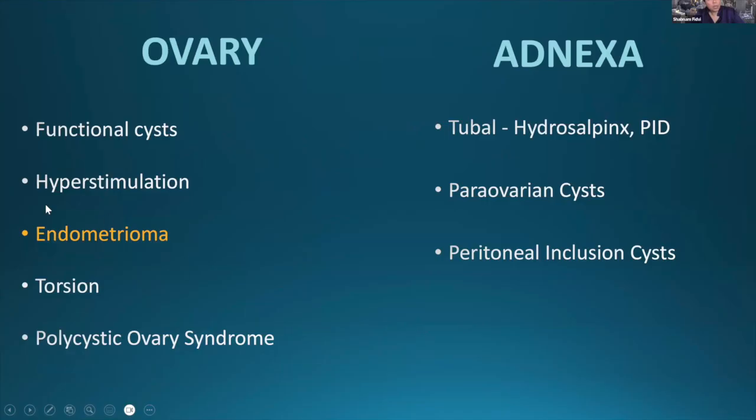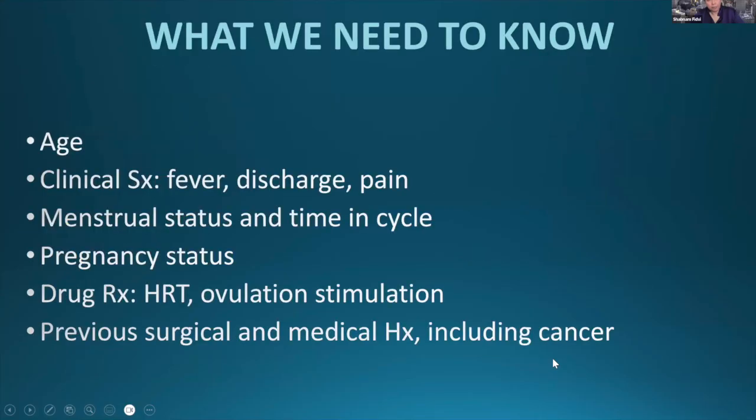I will not be talking about endometrioma because I believe this has been discussed previously in depth by one of my colleagues. In the adnexa, I'll be talking about tubal pathology, namely hydrosalpinx and pelvic inflammatory disease, and also cover paraovarian cysts and peritoneal inclusion cysts.